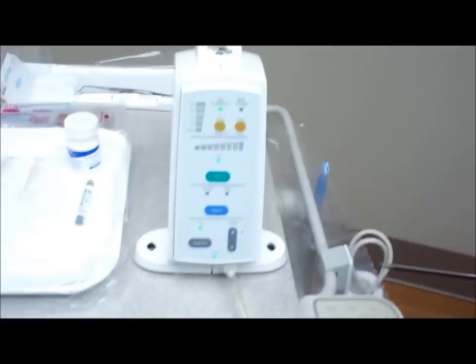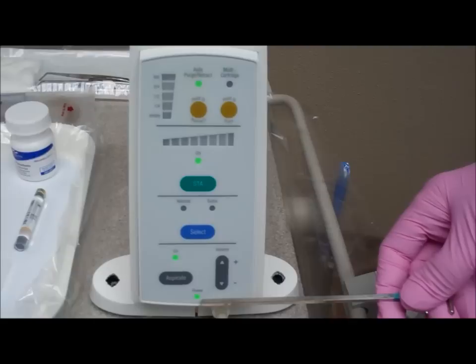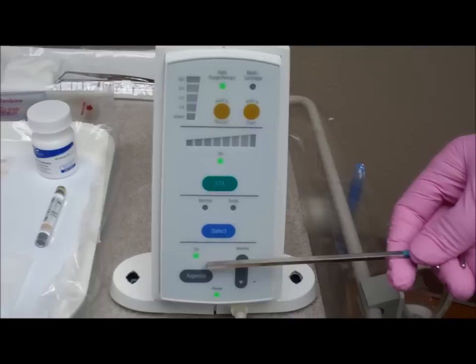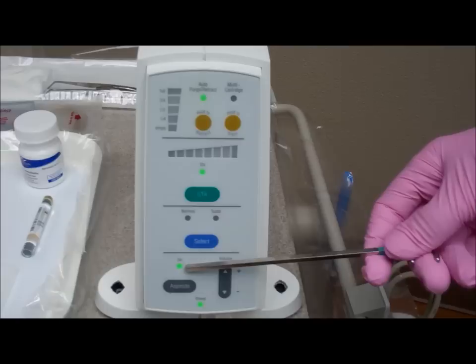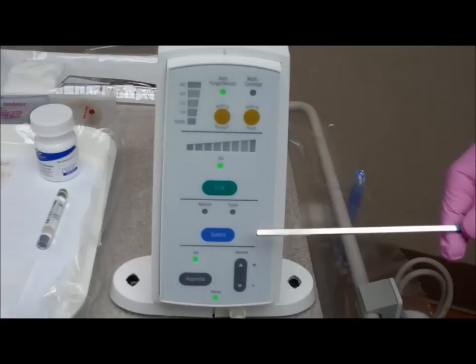There is also a needle cap holder on each side of the STA, right or left. The control panel is on the front of the STA unit. There is the power light indicator, which indicates if the power is on or off. The next button is aspiration control. You have the opportunity as a clinician to turn this on or off. Right now the light indicates that it is on. There is the volume control, which indicates how loud you would like the STA to sound.